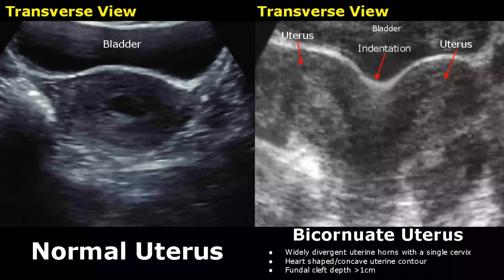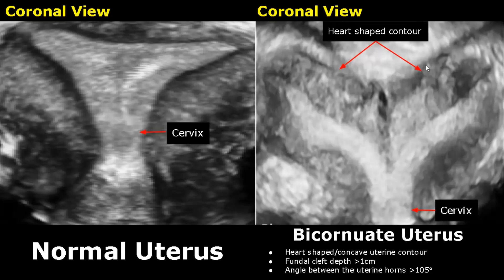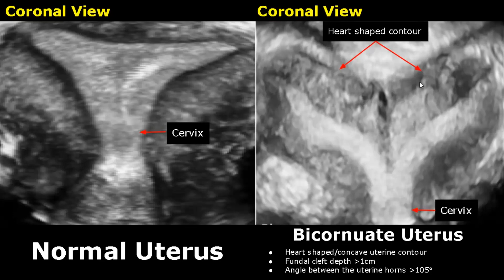In a bicornuate uterus, the uterine horns are widely divergent and there is usually a single cervix. The uterine contour is heart-shaped — it is either heart-shaped or concave-shaped, with a concave-shaped indentation visible here. In this 3D coronal view, we can clearly see a heart-shaped uterine contour. The fundal cleft has a depth greater than 1 cm, and the angle between the uterine horns will be an obtuse angle greater than 105 degrees. Both uterine horns are connected to a single cervix.